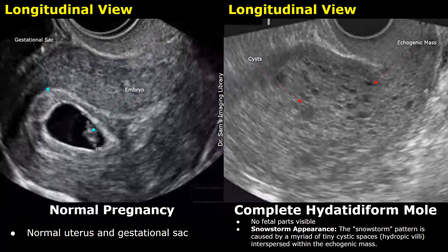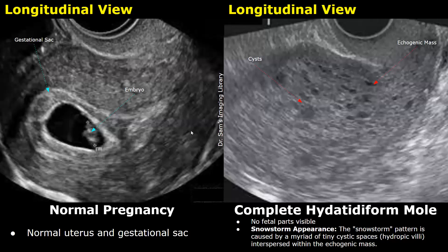We will compare the appearance of a normal pregnancy with a complete molar pregnancy. These are transvaginal images in the longitudinal plane. In the image on the left, we have a normal gestational sac with a normal embryo and a normal uterus. In the image on the right, we have a complete hydatidiform mole — no embryo or fetal parts are visible. Instead, we see an echogenic mass in the uterine cavity with multiple cysts.